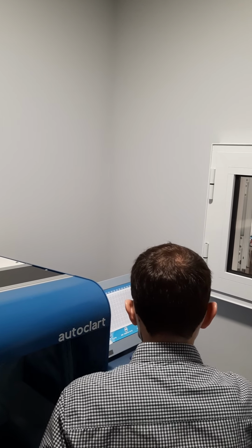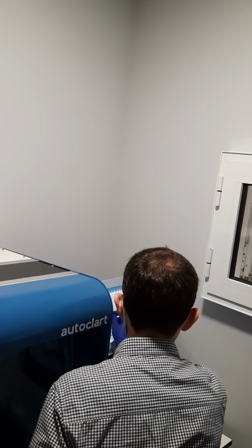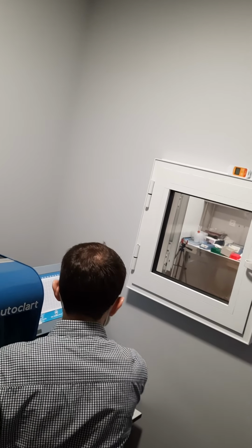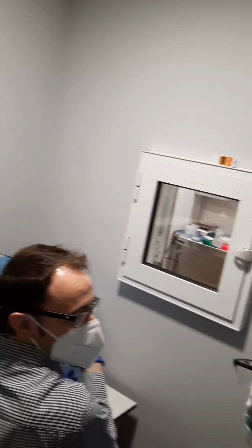We select the whole strip, right? Yes, positions. If we are going to read 4, for example, we can select 4. We can set the sample ID here, the reference or whatever. So here is where the kits are going to adjust.